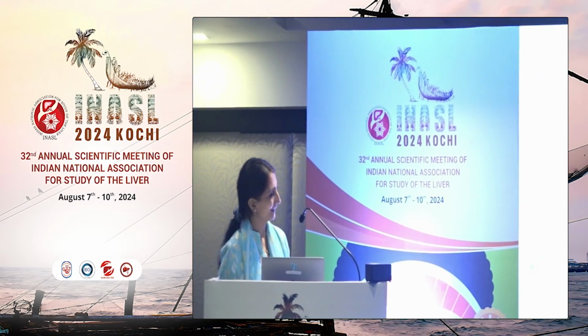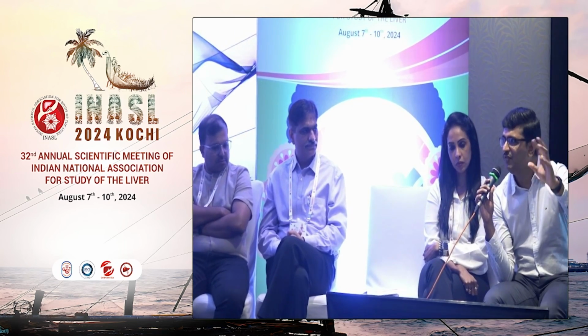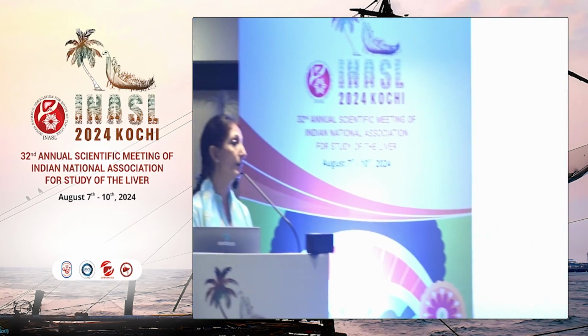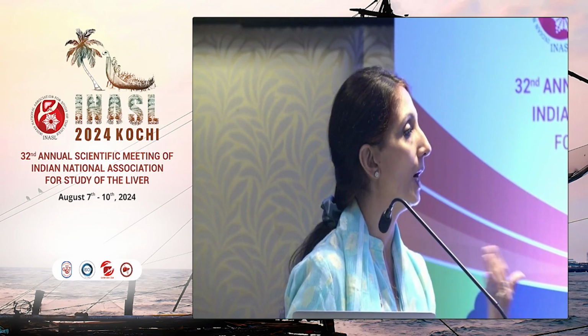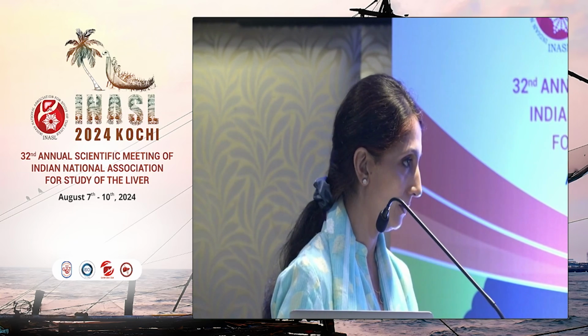Yes. Short question. In the first slide you put CEUS as an initial imaging modality after the ultrasound. In real-world practice, when you see a focal lesion, whether we offer a CT or not, how do you actually do CEUS in the real world? Yeah, real world, absolutely. I'm a big advocate for CEUS, although my favorite is MR. MR is so much easier for us to see. But in the real world scenario, CEUS is very pocket friendly and a very good modality with an experienced radiologist.